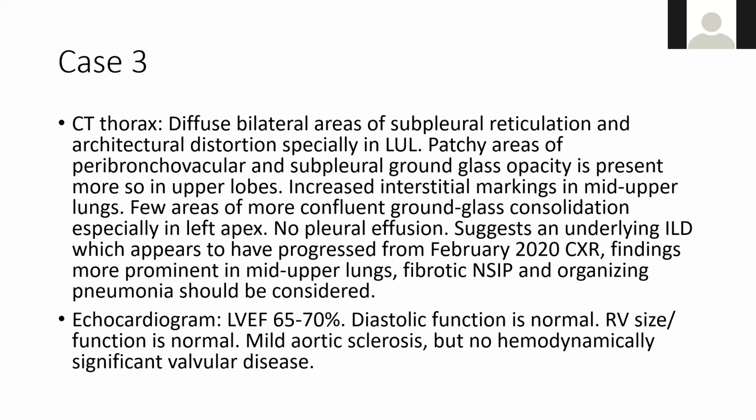She's also had an echocardiogram from that same hospitalization, which showed preserved ejection fraction, no diastolic dysfunction, and normal RV size and function as well, and no hemodynamically significant valvular disease. So fairly unremarkable.